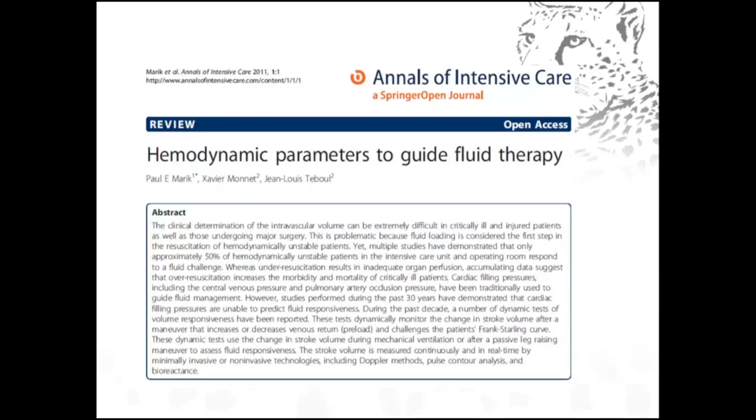If we don't give them enough fluid, we don't perfuse the organs. If we give them too much fluid, it actually increases their mortality and morbidity. So the static values like CVP and wedge only predict fluid responsiveness 50% of the time. On the contrary, the dynamic parameters can actually tell you whether a patient is fluid responsive or not.